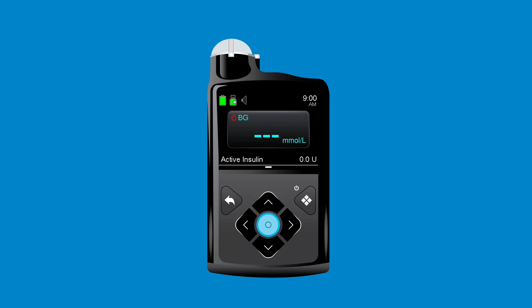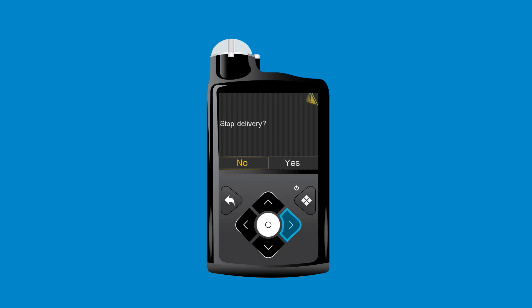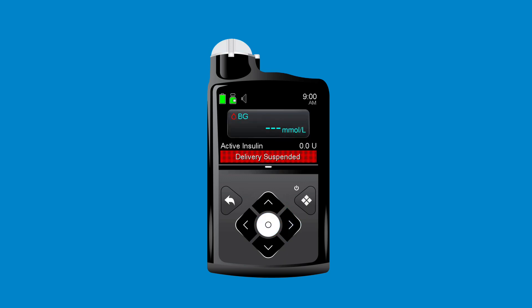From the main menu, Anna selects Suspend Delivery. She presses right and selects Yes to suspend delivery. The confirmation screen appears, showing that the pump is suspended. The home screen now shows delivery suspended in a red banner as a reminder.